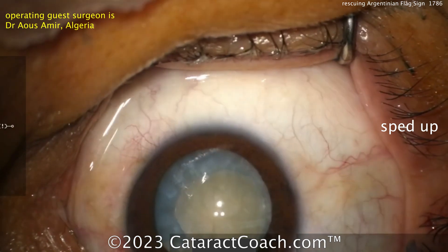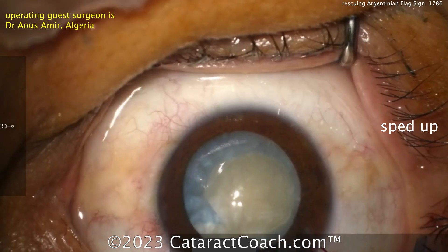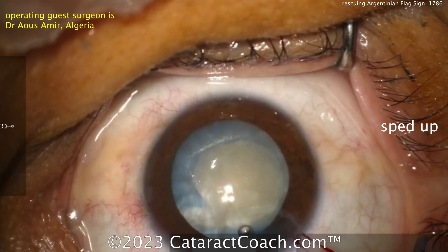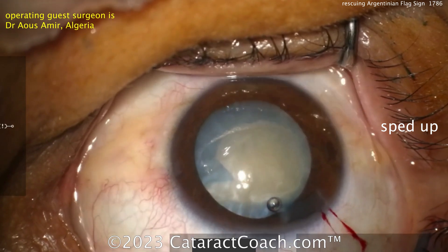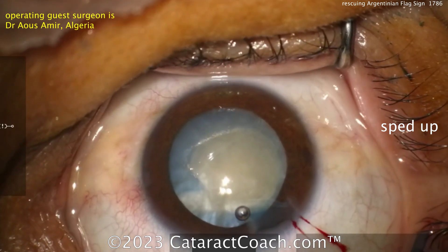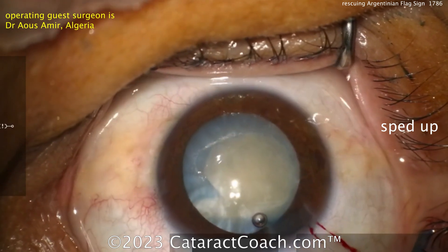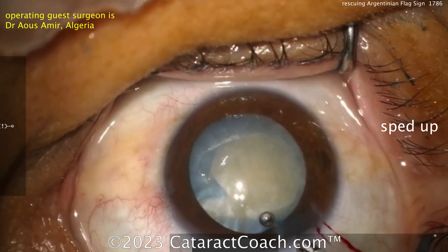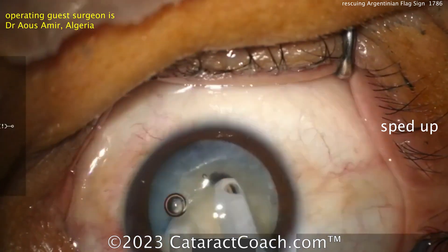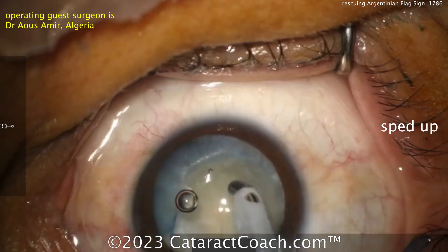Do you create extra points of radialization, like a can-opener style, so that you have more forgiving tissue? Because right now if you just have that one area at the bottom of your screen, as you do nucleus removal and work within the bag, you could push down on the bag and cause that to rip around to the posterior capsule. But if you have multiple points — that's the idea behind the old can-opener capsulotomy technique — you'd spread that risk around and wouldn't have as much of a risk.